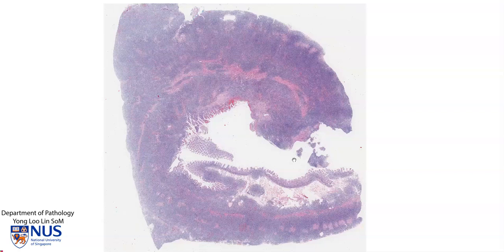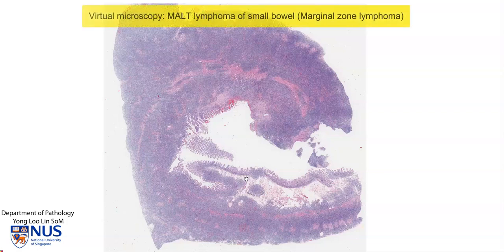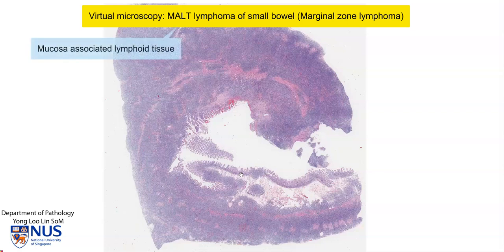Hello. This is a virtual microscopy slide of a case of MALT lymphoma of the small intestine or small bowel. MALT stands for mucosa-associated lymphoid tissue. It is a type of marginal zone lymphoma, which is a low-grade B-cell lymphoma.